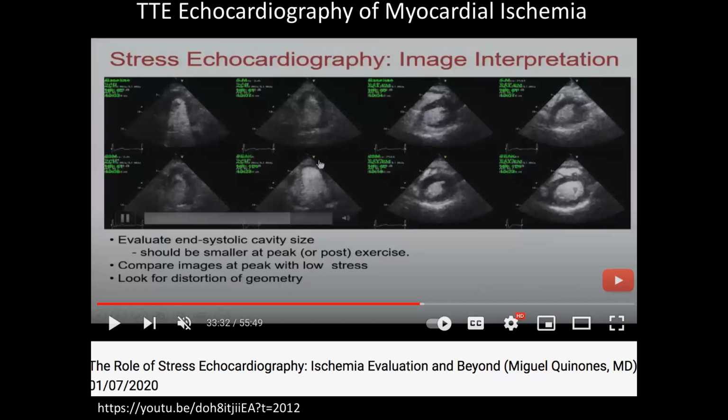So you could do it in real time. You just start taking your data. Looks terrible. You can't see a border in the heart. You inject the bubbles, and it doesn't last long. You inject it, and then in real time you can see it. Okay, I'll get some data on what those bubbles look like for the next class.